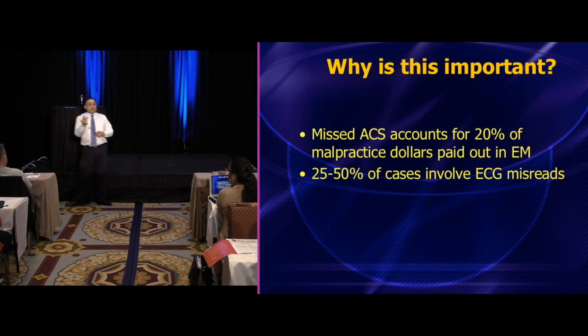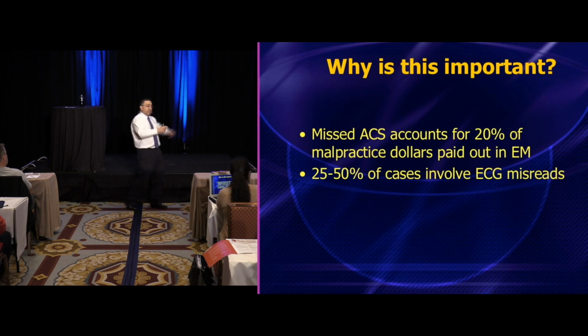But when it comes down to the ECG, oftentimes this is objective information, and it's very difficult to argue when the lawyer blows up that ECG, and even a layperson on the jury who's only experienced in emergency medicine is watching the TV show, right? They can look at that ECG and say, oh yeah, even I can see a half or 3/4 millimeter ST depression in V2, 3, 4, 5, and 6. And we'll see that happen all the time.